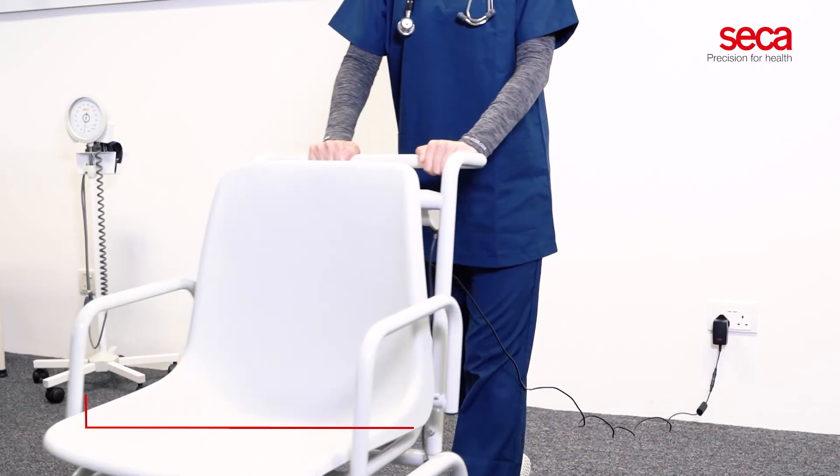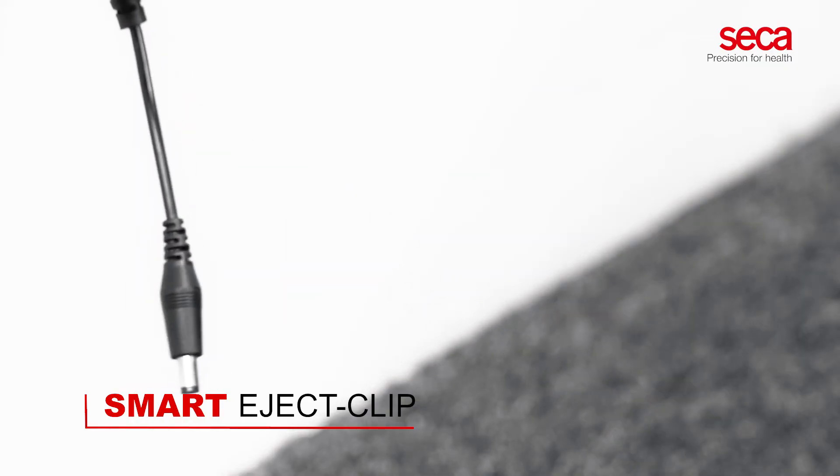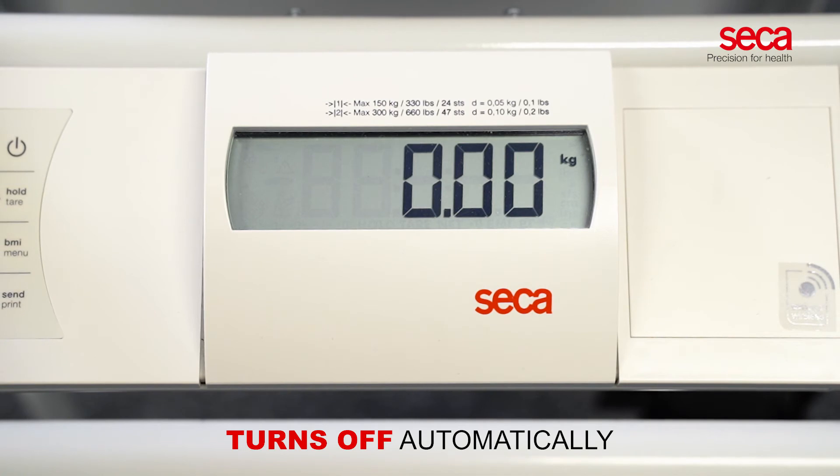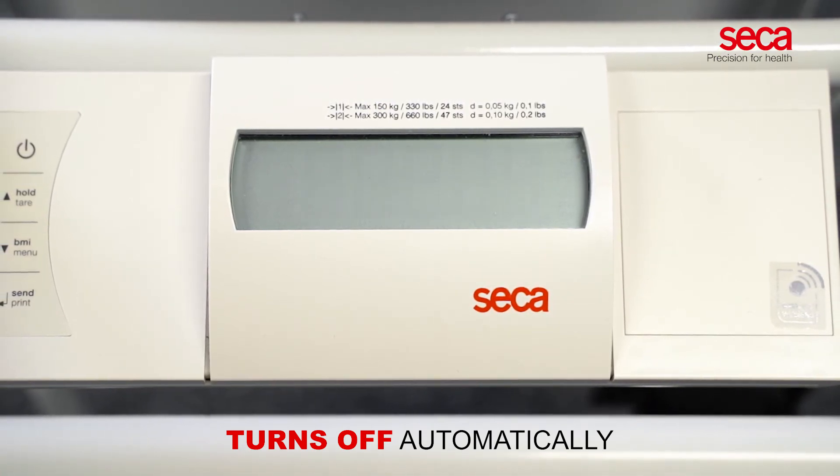The charging cable is designed with a smart eject clip to avoid power outlet damage. To ensure a long battery life, the Sika 954 turns off automatically when not in use.